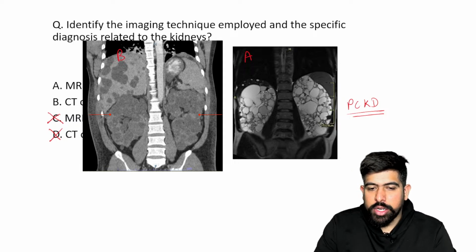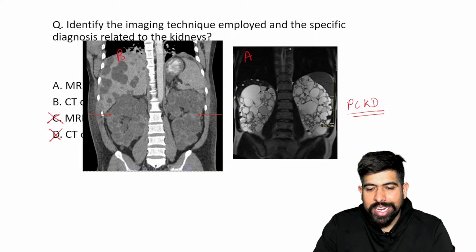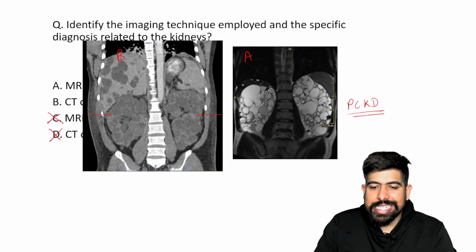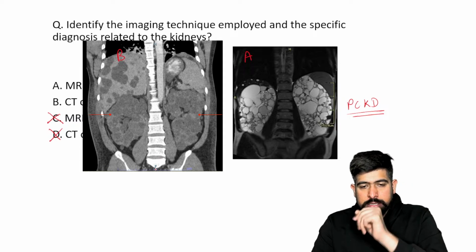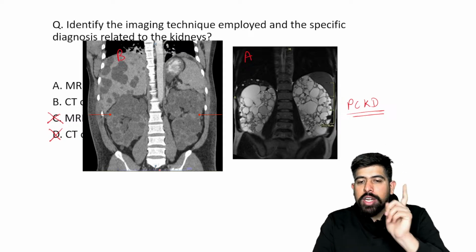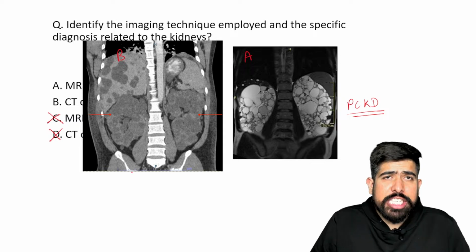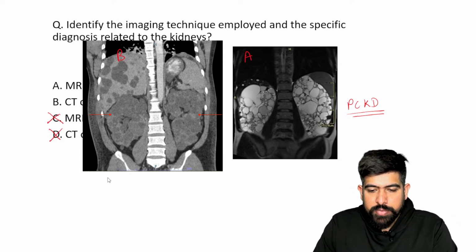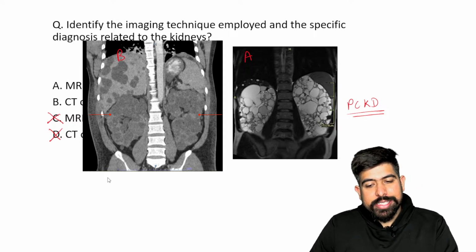Very good, doctors. Which is shown in the MCQ? That is the MRI. And the image which I put as image B, that is your CT scan. Sir, how do you identify that this is the CT scan? You already know from part 1 of radiology. I already told you which rays are used in the CT scan. Yes, A is the MRI, B is the CT.